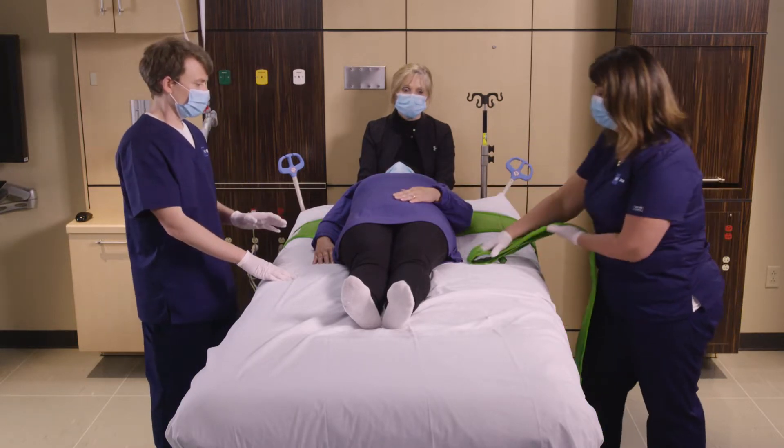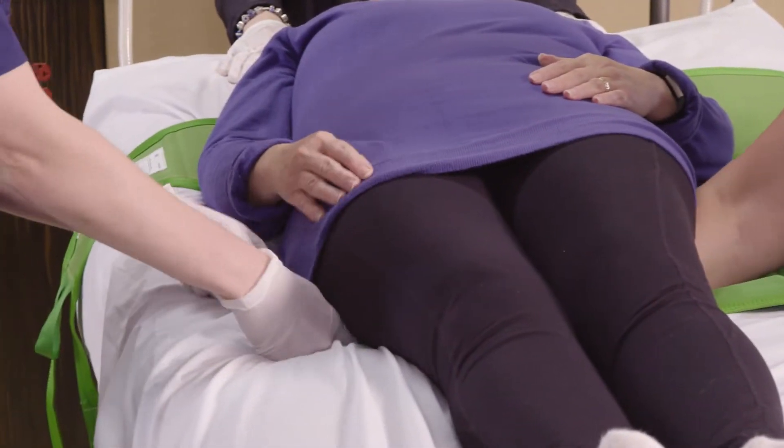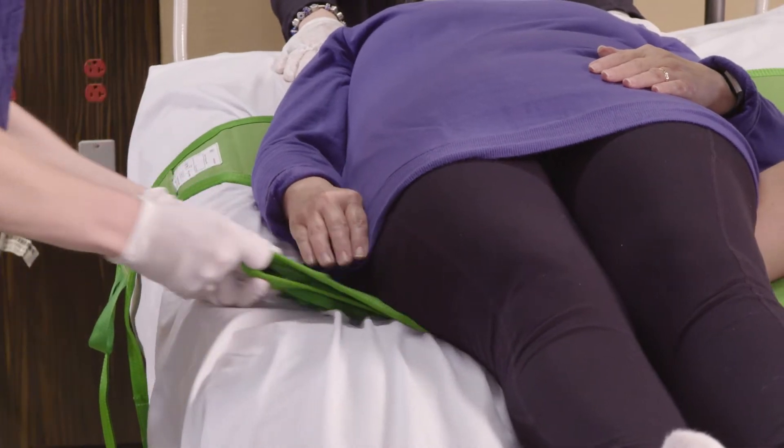The second strap, the lower strap, is going to be placed so that the top of the strap is approximately aligned with the trochanter.